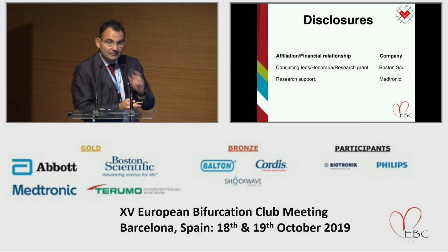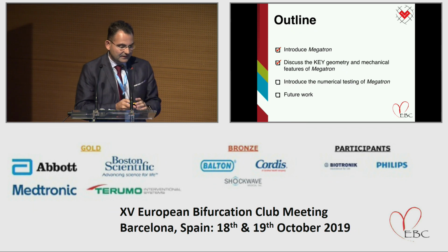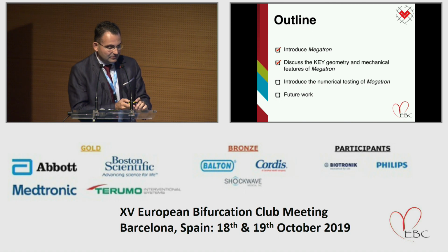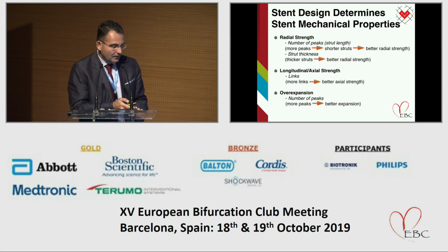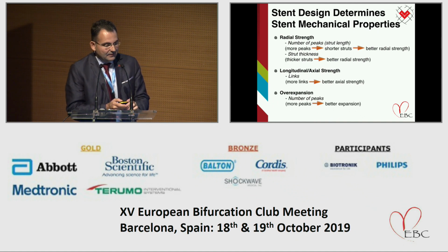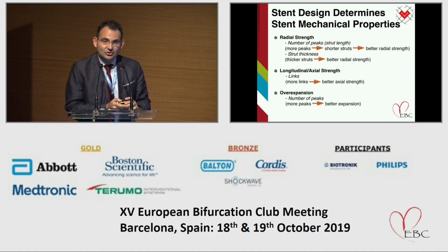Yes. Okay, those are my disclosures. The outline: I'm going to very briefly introduce the Megatron and discuss the key geometry and mechanical properties of this stent. Then I will introduce the numerical modeling and testing of Megatron, and then some future directions. So, as Thierry mentioned, stent design dictates the stent mechanical properties. And there are several mechanical features that characterize a stent. Those 3 are really important: the radial strength, the axial strength or longitudinal strength, and overexpansion capability.